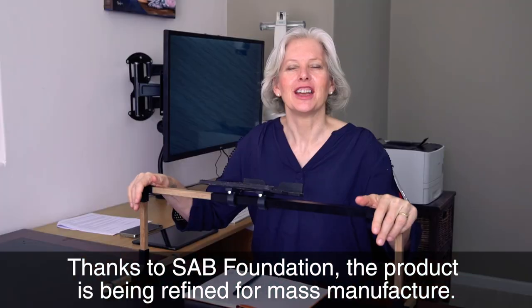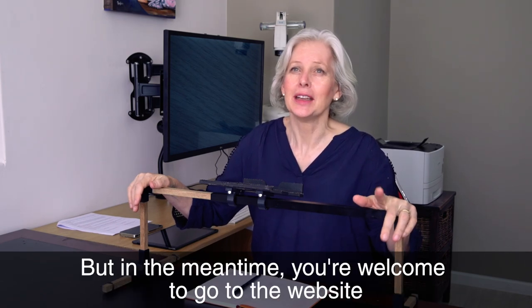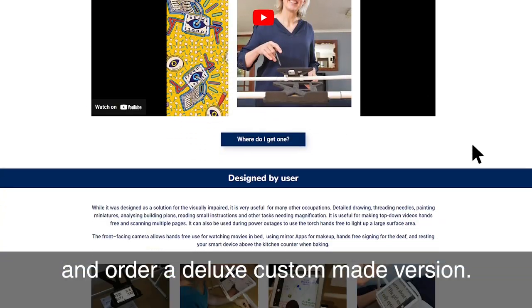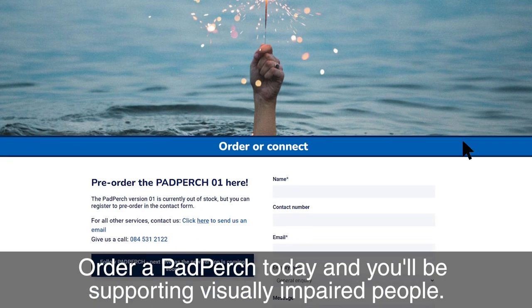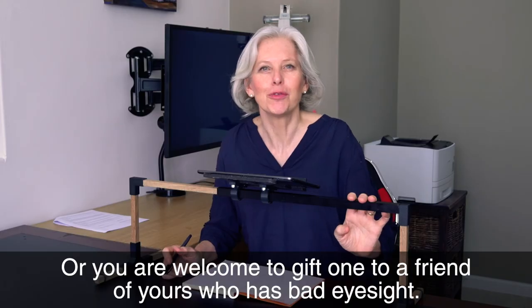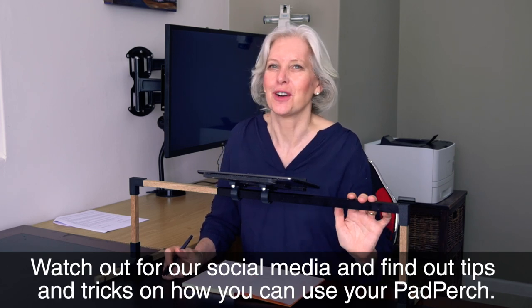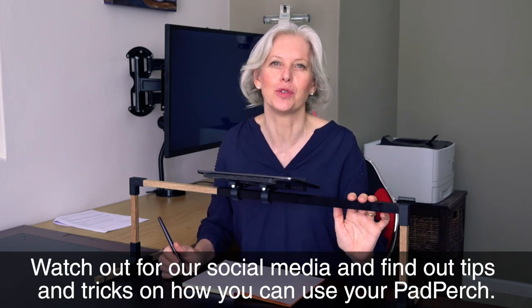Thanks to SAB Foundation, the product is being refined for mass manufacture, but in the meantime you're welcome to go to the website and order a deluxe custom made version. Order a PadPerch today and you'll be supporting visually impaired people, or you're welcome to gift one to a friend who has bad eyesight. Watch out for our social media and find out tips and tricks on how you can use your PadPerch.